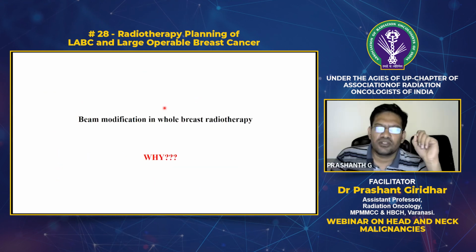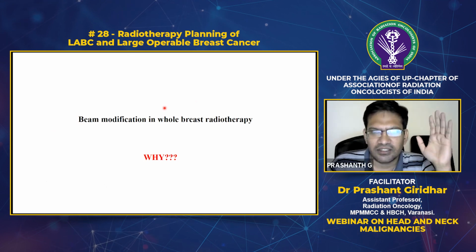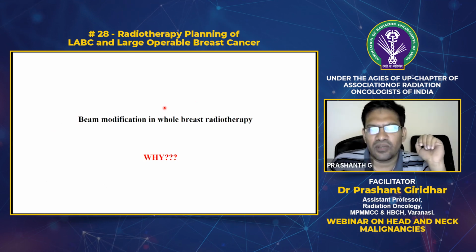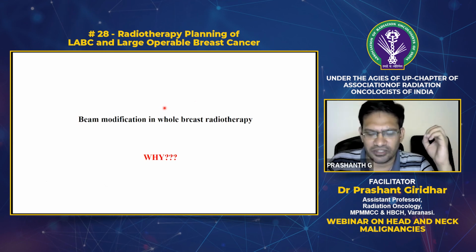Right. So the next point is beam modification. Now we have placed basic tangential fields. Then we have to find out if any form of beam modifier is to be added in whole breast radiotherapy.